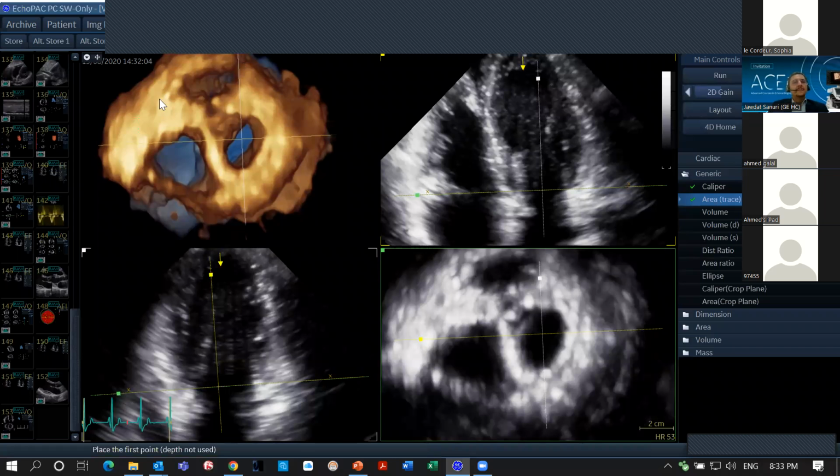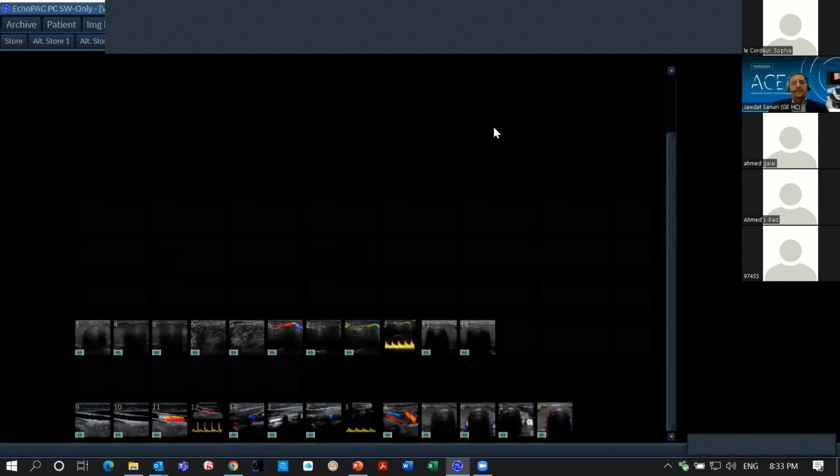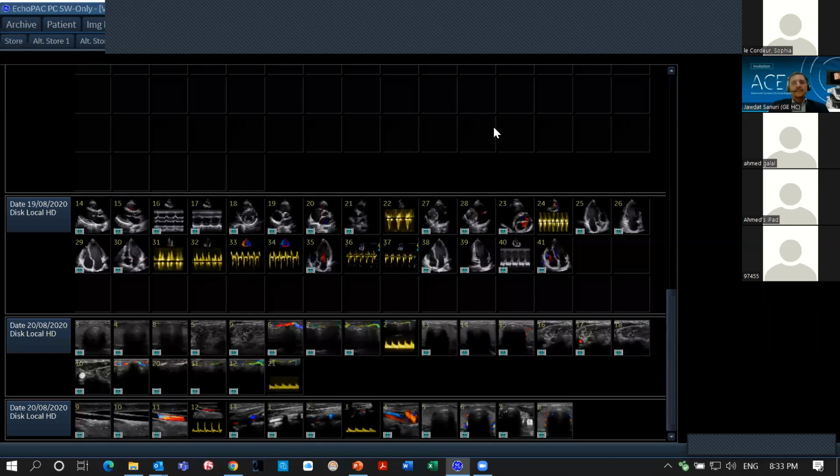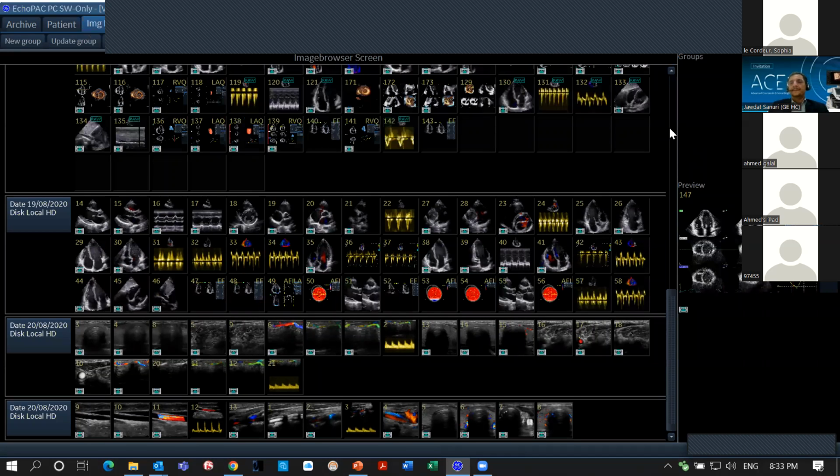But if you do it in the MVQ, you will get a number like 10 or 8, too big. I don't know why the number is usually odd there, which is not appropriate to be used. Here is better actually, but here also the resolution is not so good to be sure.